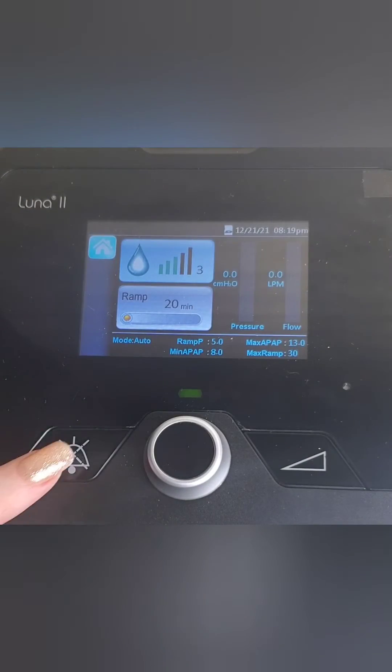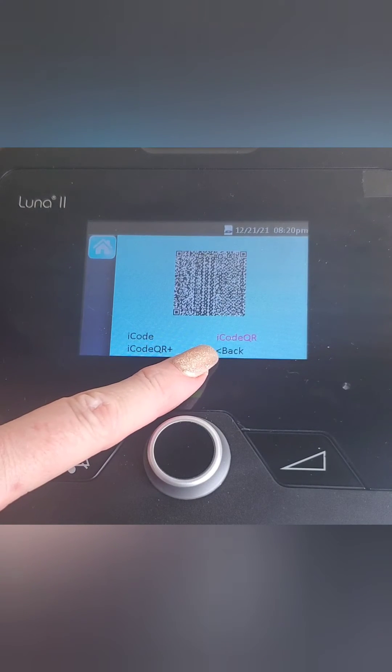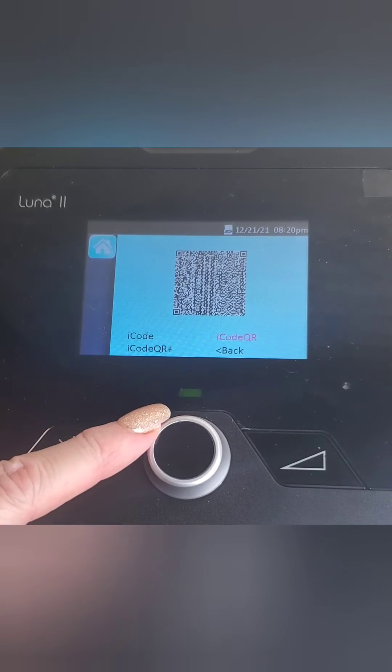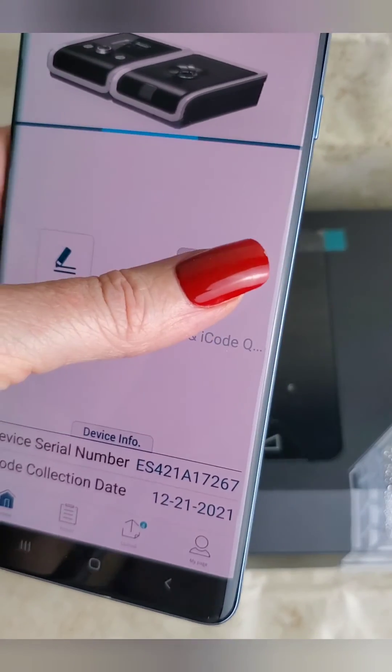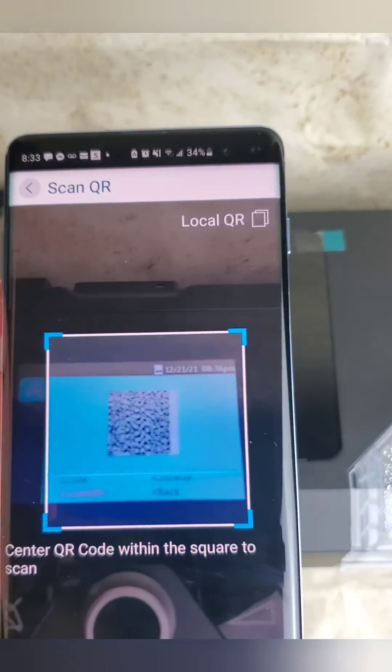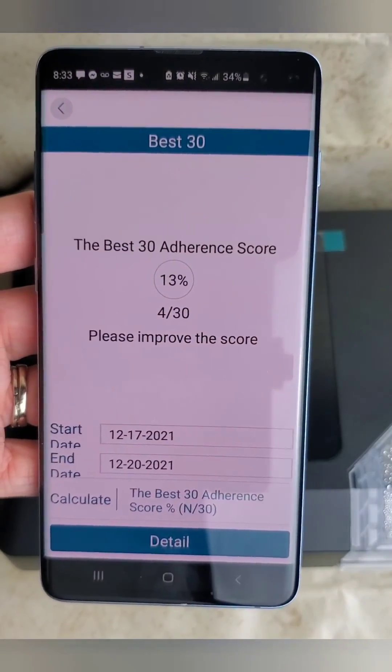Now that we have the app installed on our phone, we're going to take a picture of the QR code on the top of your machine — and it couldn't be easier. You're going to hit the button to the left of your knob; it's going to pop up your iCode QR. Then you're going to turn the knob one to the right to get iCode QR plus. Then you hit the button on the app and you scan the barcode. That's it — you're ready.